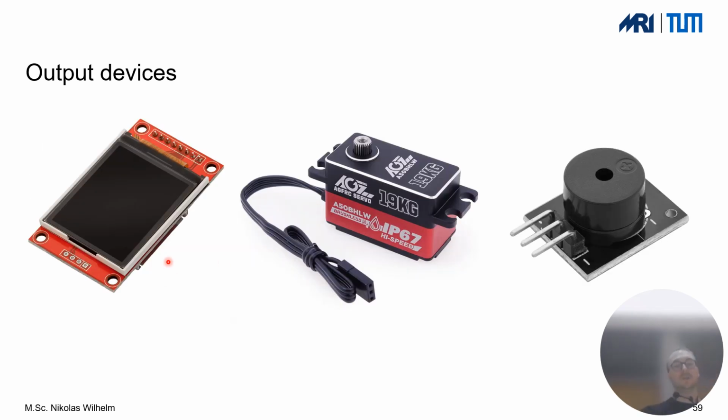And then finally, we can also talk a bit about the output devices. So now we talked about how we can measure things using digital and analog sensors. But of course, we would also like in the end to give feedback, for example, or output something. And this we can do with, for example, external monitors, or the classical thing, the most recommended one: if you have an actuator, you want to, of course, control that actuator in a certain manner, or for example, something simple like outputting sound.